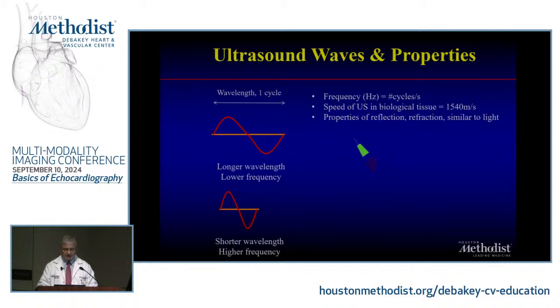So if we take a transducer, on the tip of the transducer are some piezoelectric crystals, and these crystals are very responsive to 2 things, but nowadays we use one thing. It used to be responsive to a mechanical stimulation. So if you stimulate a crystal, it will emit a certain wave, but nowadays we could excite it with electricity.